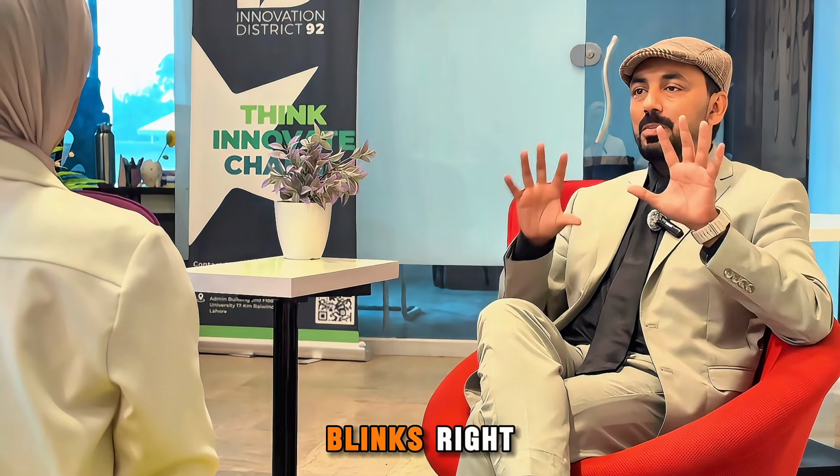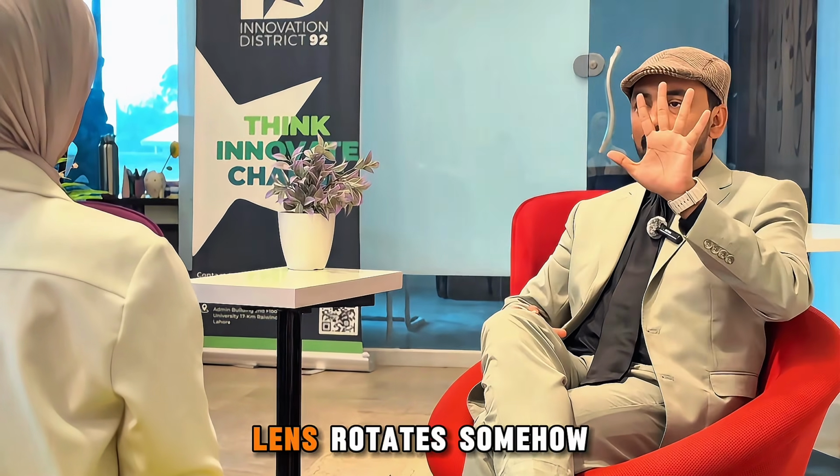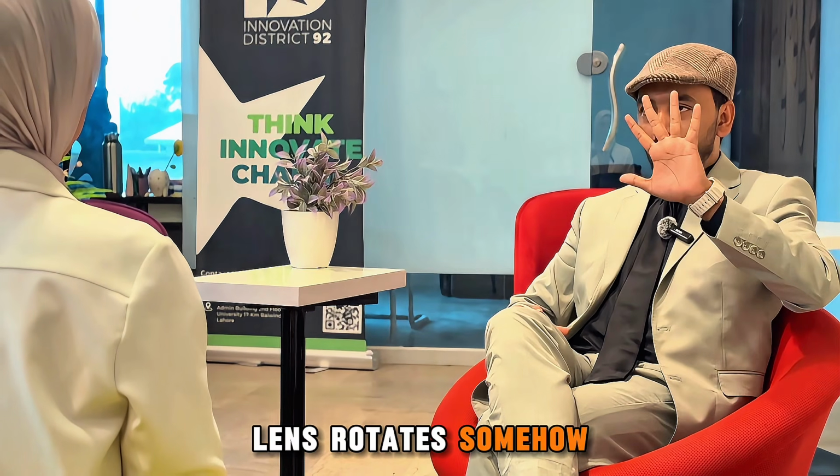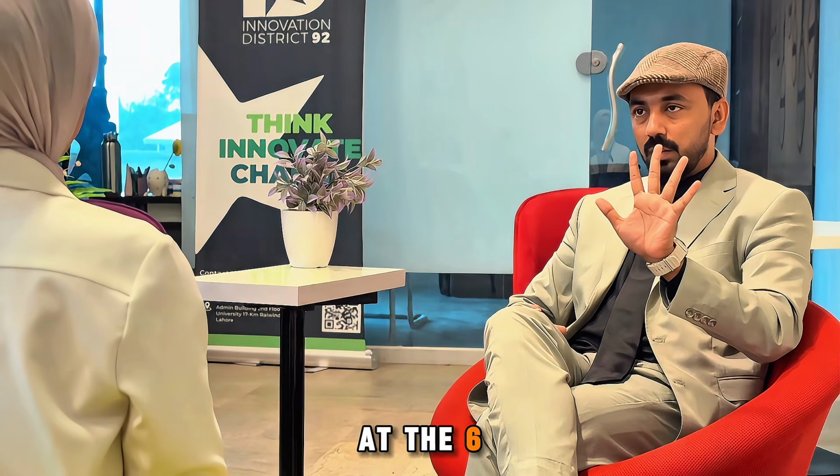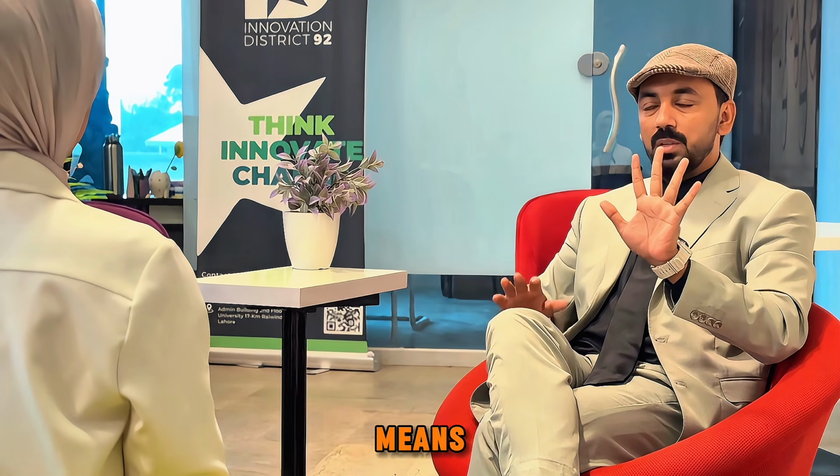For example, when we insert a toric contact lens in the patient's eye, and when the patient blinks, if the contact lens rotates somehow and will regain its position again at the 6 o'clock position, it means that there is no need to apply the LARS rule.